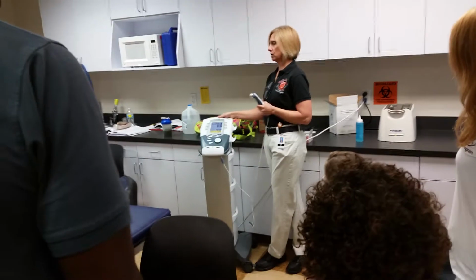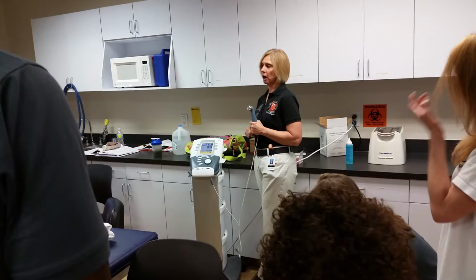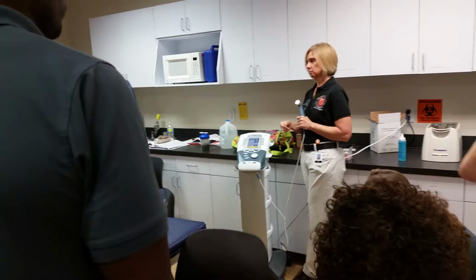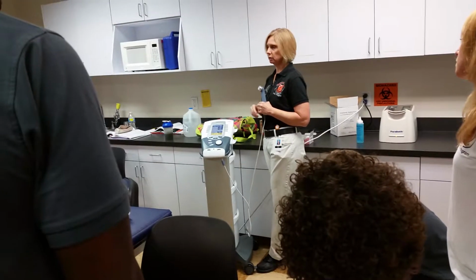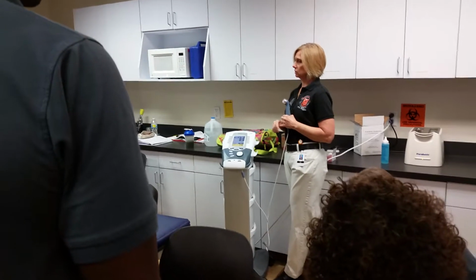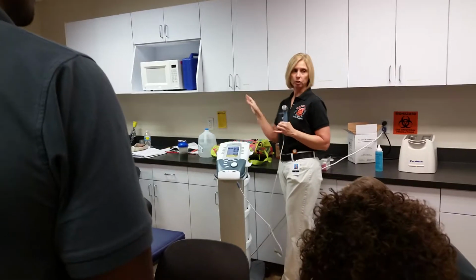And if it's continuous, I'm expecting you to do the treatment until the person begins to feel a mild warming sensation. It typically takes about a minute to get to that point. Your book says 2 to 3 minutes, but usually by a minute you're starting to feel the warming. If you're not feeling it after a minute, you can increase the intensity. If you are feeling it, you can stop. You're at where you need to be.